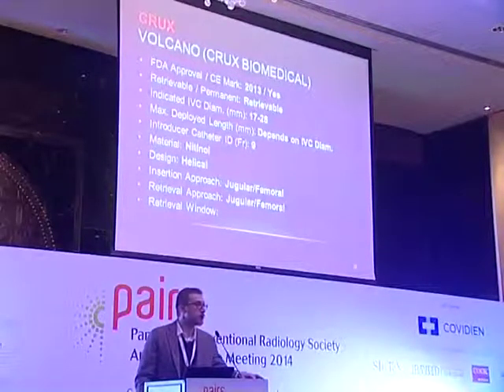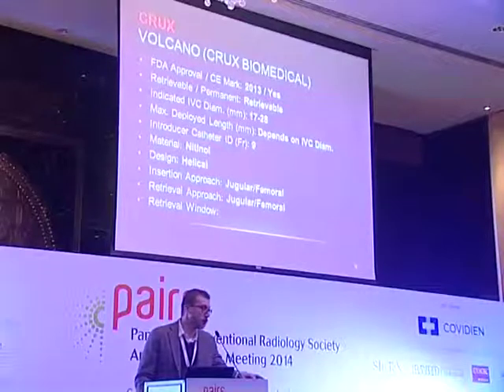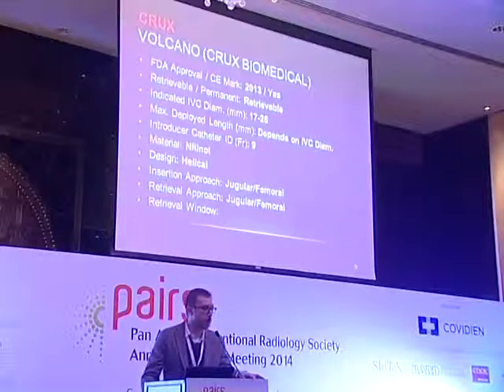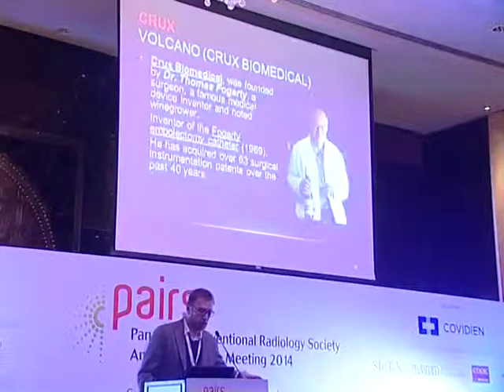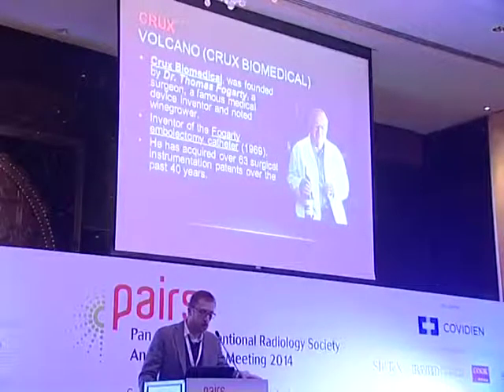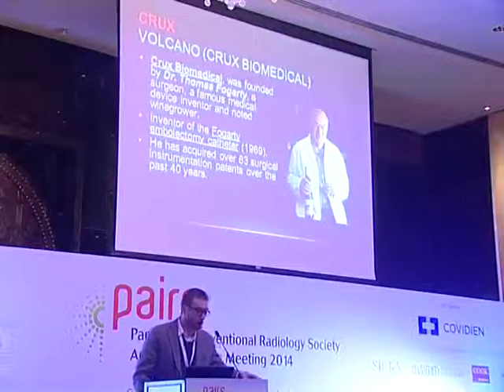All other filters are usually one-sided retrieval, either jugular or femoral, most of which, especially the conical ones, are jugular retrieval. It was developed by Crux Biomedical, which is a company that was started by Thomas Fogarty, who invented the famous Fogarty embolectomy catheter.